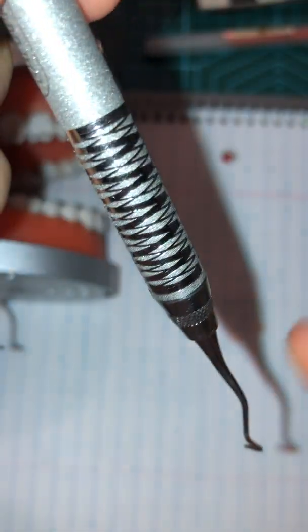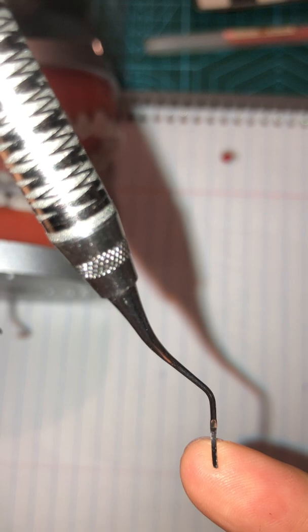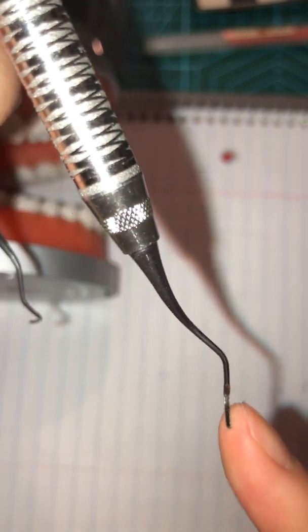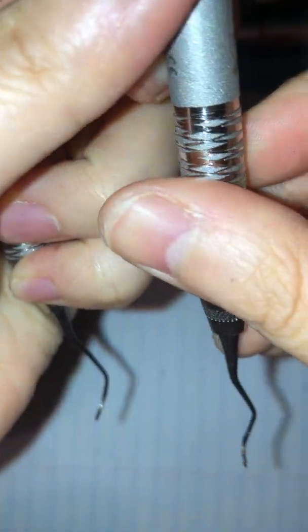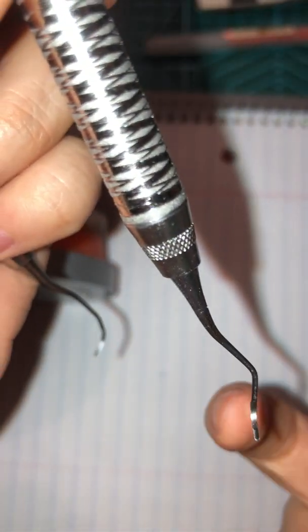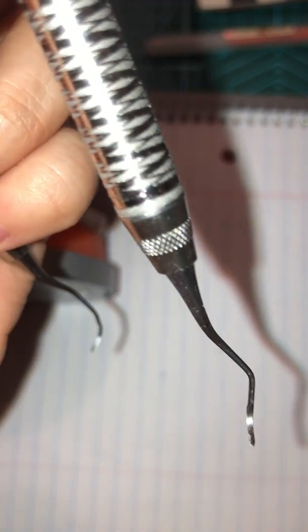the 15-16, you can actually tell that this side is lower. And if you look at the 13-14, you tilt it straight, this side is actually lower.